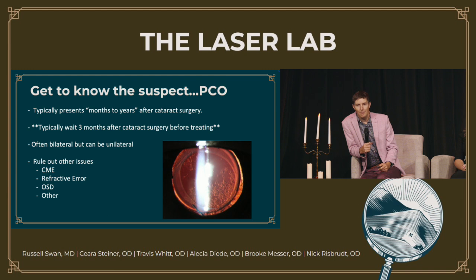So, Brooke, I'm going to throw this to you first. When you're seeing a patient that's being referred in for PCO or for a possible YAG, I'm just curious what things you're thinking about, what things you might also be looking at besides PCO that might affect your decision for taking care of a patient.